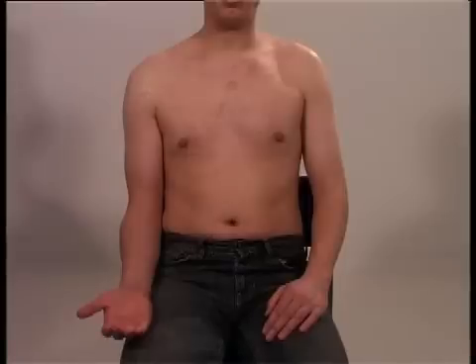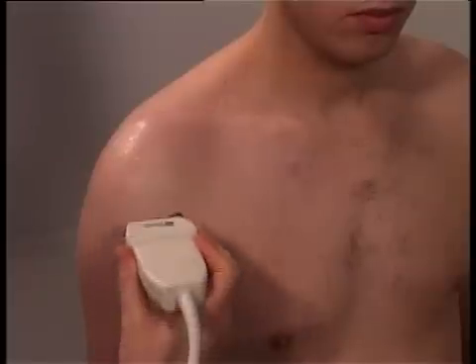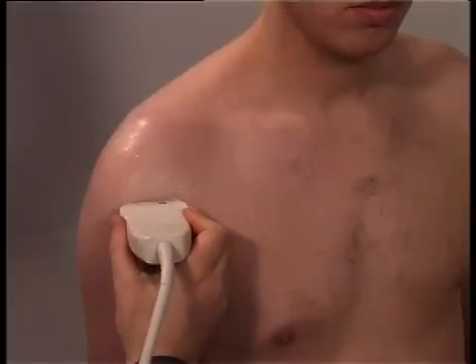The patient is seated with the elbow flexed at 90 degrees, palm in supination resting on his thigh. The probe is placed on the anterior aspect of the shoulder, 4 to 6 cm below the acromion.